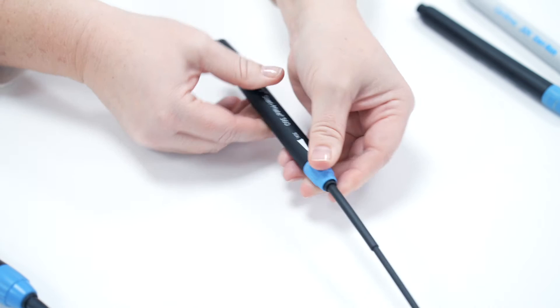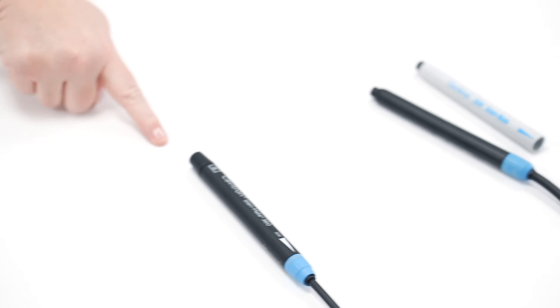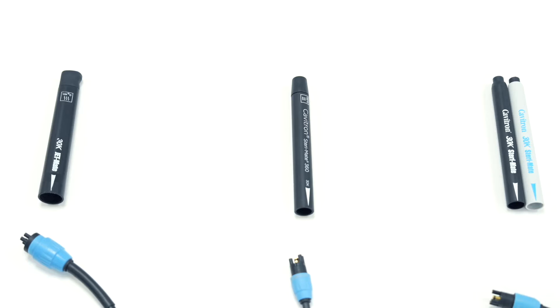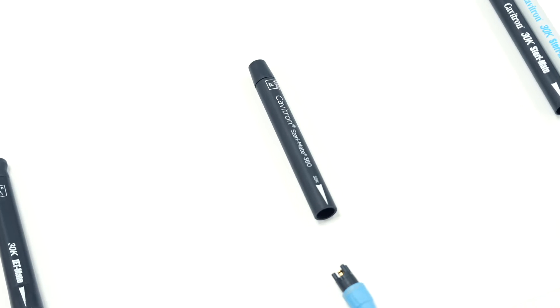All Stereomates have a 6 month warranty, so the manufacturer date will give you an idea of how long you've had the Stereomate and should be linked to the purchase invoice. In 2017 we launched a new digital Cabotron called the Touch, and we made changes to the Stereomate so that it had a rotating 360 degree grip. In 2021 we launched an updated digital Cabotron called the Cabotron 300, which also uses the Cabotron 360 Stereomate.